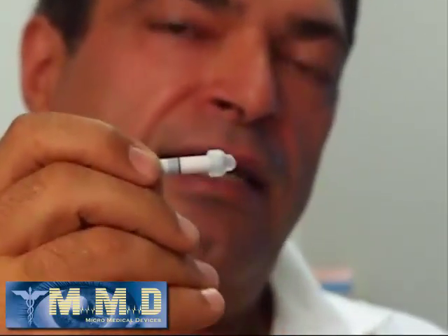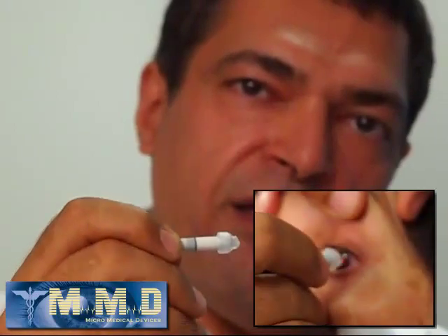Just hold it on the eye and instruct the patient to look at the blinking light. To ensure the patient is fixating properly, ask them to look at the blinking light and move the probe back and forth to confirm they are following it. That way you know they are looking directly at the light as you approach the cornea. Your approach should be very gentle so that the meniscus and the eye couple together, giving you very good immersion captures with high accuracy.